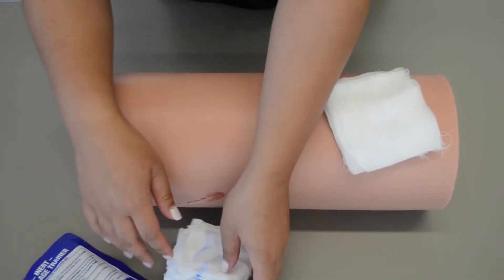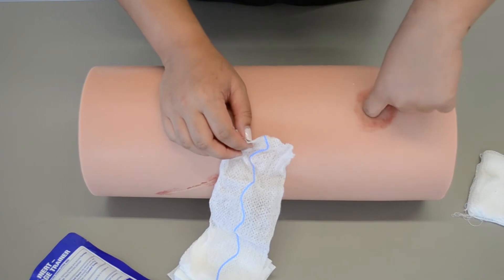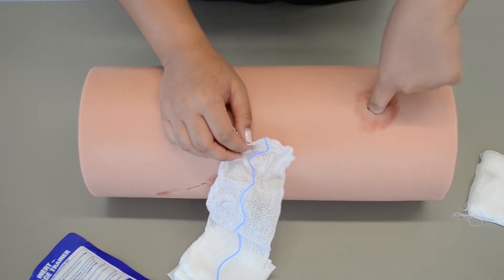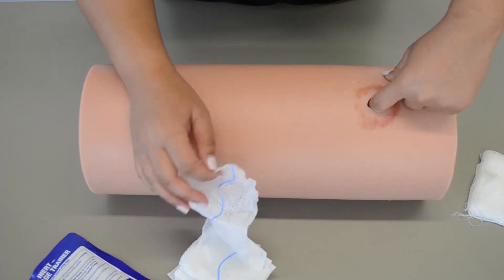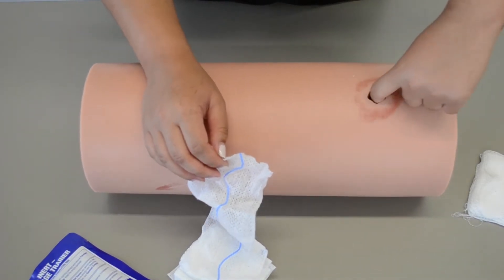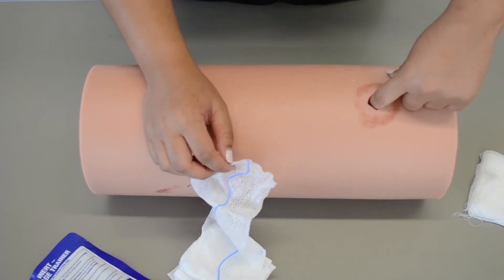I'm going to go ahead and take the combat gauze out, open it up, and then locate the source of the bleeding. It's going to feel something like a hose with a little kink in it and the water's coming out, so I'm going to look for something similar to that. I'm going to stick my finger in there, find the bleed, and leave my finger in there.